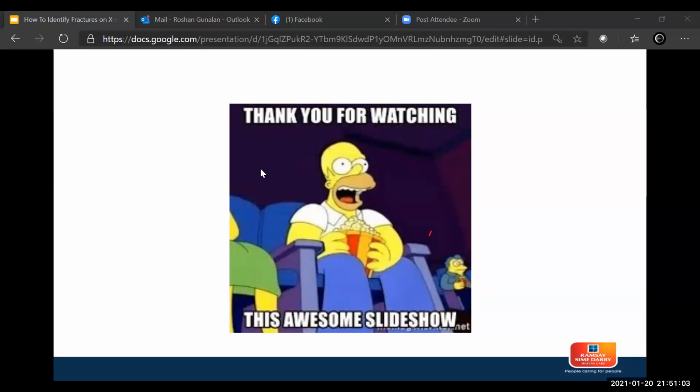Do we use AO classification to describe fractures? Yes, if you're doing a master's in orthopedics, yes. AO is a very comprehensive way of classifying fractures, very advanced as well. For those who are contemplating doing orthopedic surgery, knowing the AO classification is very important and very useful, because it gives you management-wise the patterns, and they've even come up with a pediatric version of it as well.